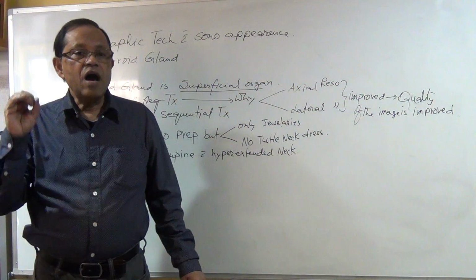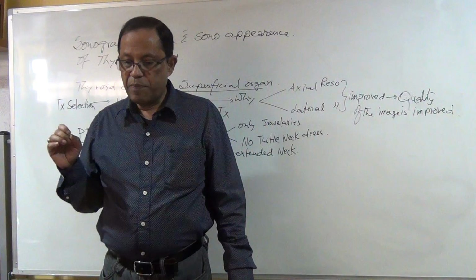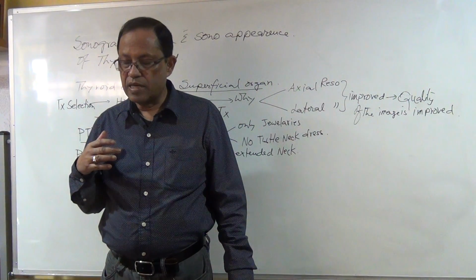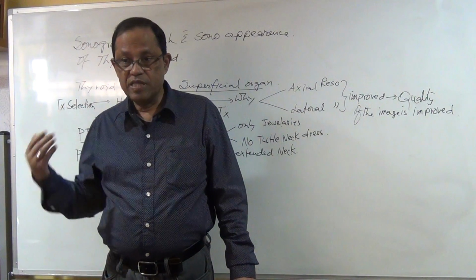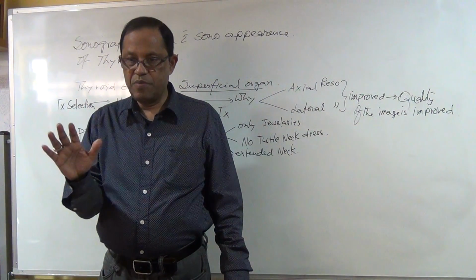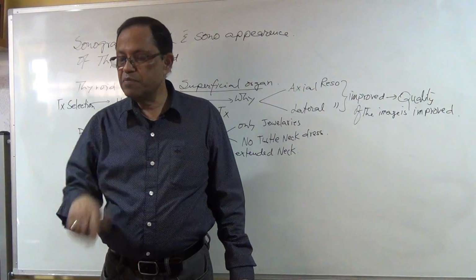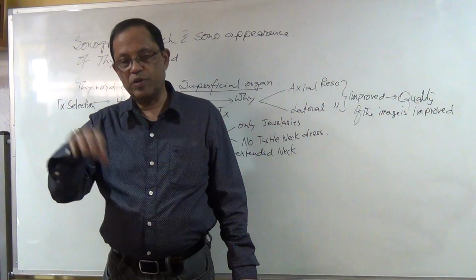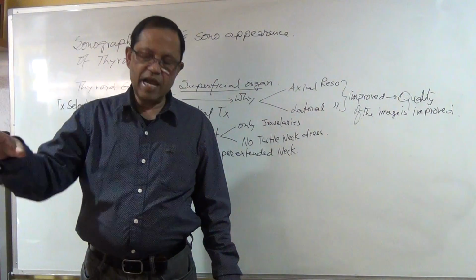Now, you can think, if the pain is in the neck, that means so what? I cannot do any ultrasonography. I have to send the patient back. No, don't send the patient back. Out of 20 images, as much as possible do it. If you get 12 images, 10 images, get it.